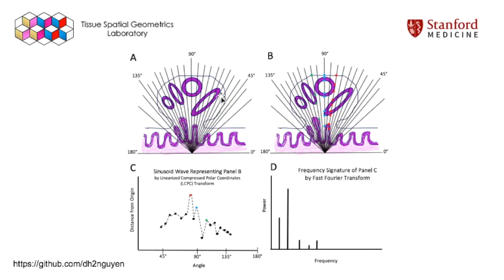In this case, the inspiration for developing the LCPC algorithm was to characterize colon polyps, benign colon polyps. And so here is a cartoon of a colon polyp. It is a bulge out of the colon wall, and it forms a lot of tubes that are disordered inside of it compared to the orderly wavy tubey structure of a normal colon lining.